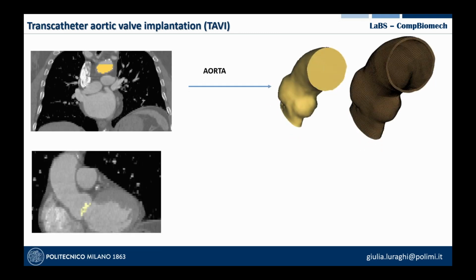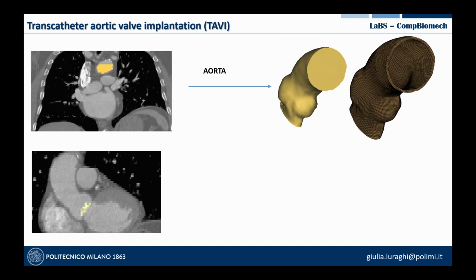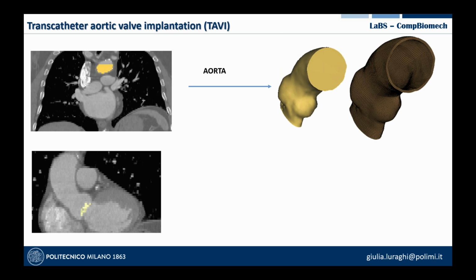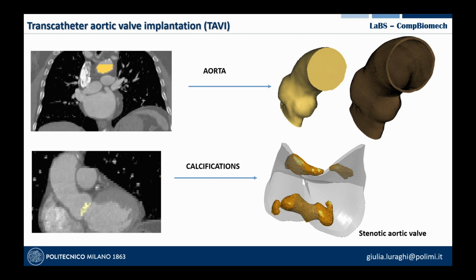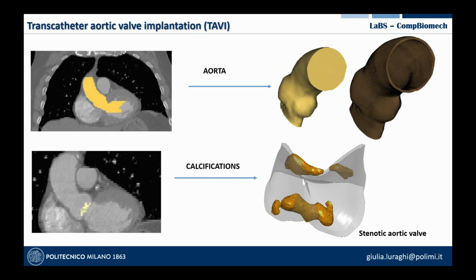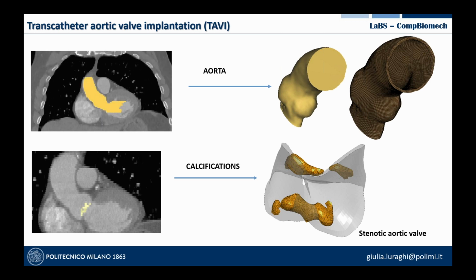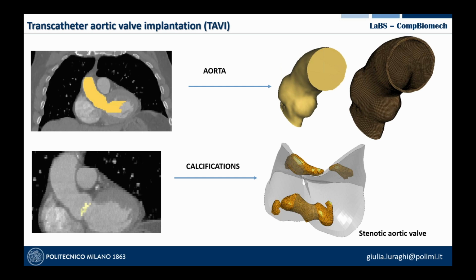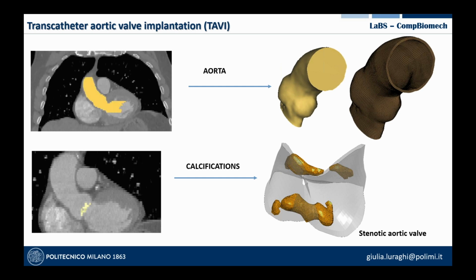Regarding the pathology, the stenotic valve presented some calcification on the leaflets themselves. The calcifications are visible with the CT images. And so we segmented the calcifications again to have a solid element joined to the leaflets of the patient.